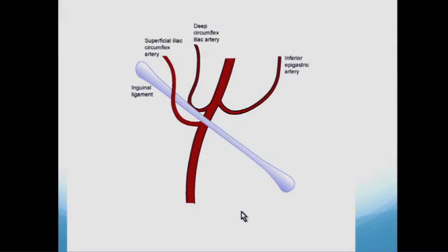Starting on the femoral artery and vein, follow the femoral artery up until you see the superficial iliac circumflex artery going laterally. Go up a little further and the next laterally proceeding artery is the deep circumflex iliac. Go up a little more and you'll find the inferior epigastric artery — that's the marker for your deep ring.